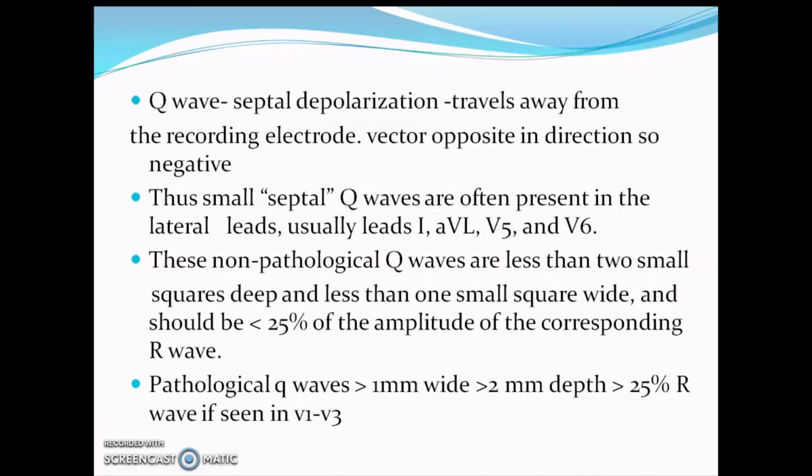The Q wave here is a septal Q wave. Initially the septum depolarizes from left to right in direction, so the vector is in the opposite direction. The small Q wave is normally present in the lateral leads, that is 1, aVL, V5, V6.